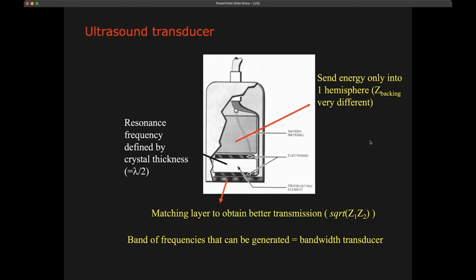Now, in reality, of course, it is based on a piezoelectric crystal, but we're not putting this crystal itself on the skin of the patient. What we do is we create a full transducer that we then put on the patient. The purpose of this transducer is to send out the ultrasound waves, and at the same time also receive these ultrasound waves, but only in the direction that we want to do the imaging. So in reality, a transducer would roughly look like this.